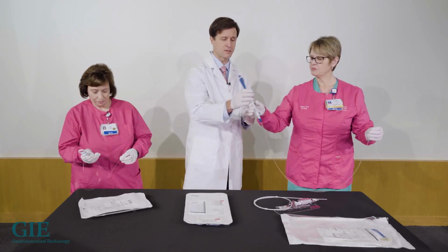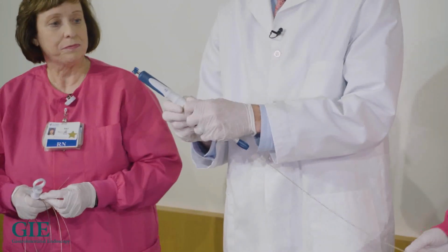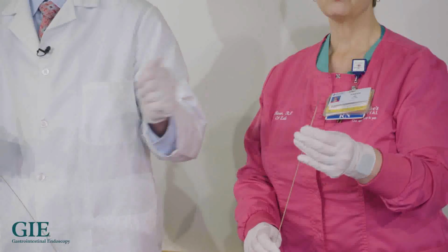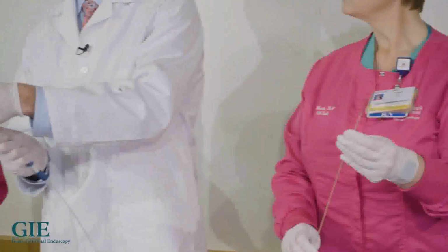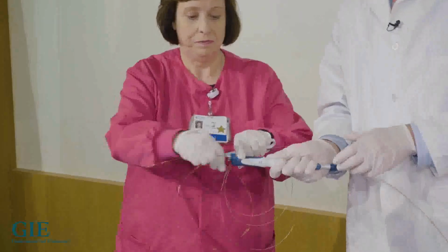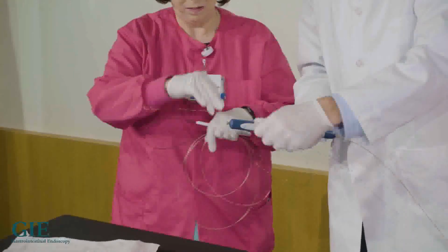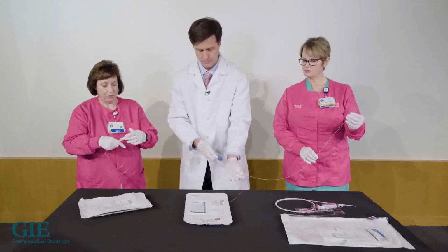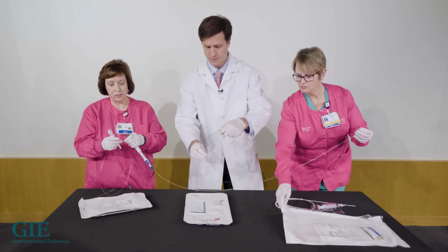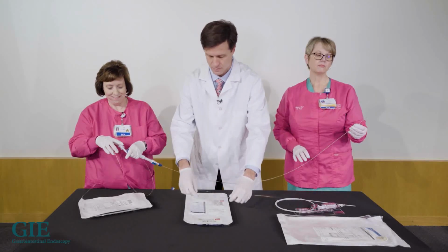So we have our needle here. With our needle, you're going to unscrew this portion so you can take the needle and puncture the cyst. See the needle comes out of the EUS-FNA. And then, once you're inside the cystic lesion that you want to sample with your through-the-needle forceps, you're going to take out the stylet. Set that to the side. Make sure they're closed before you put it down.